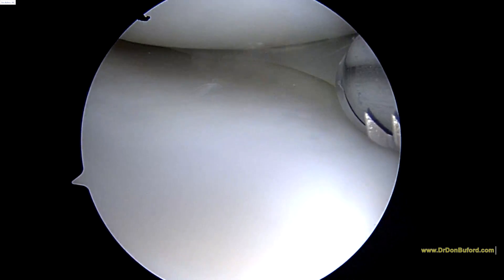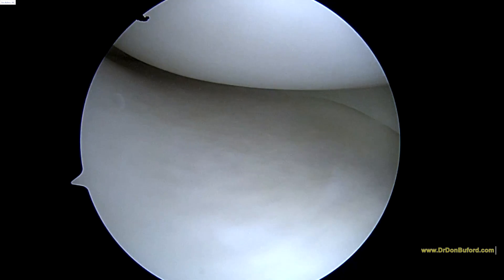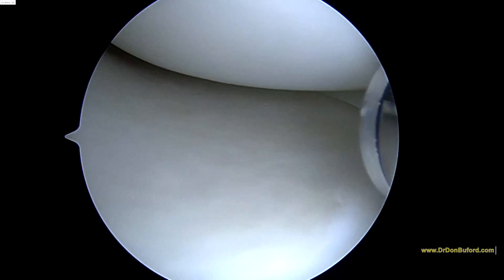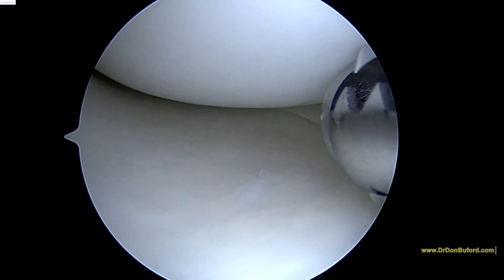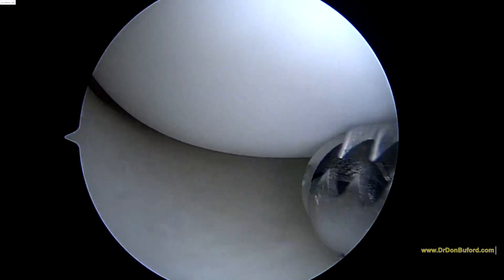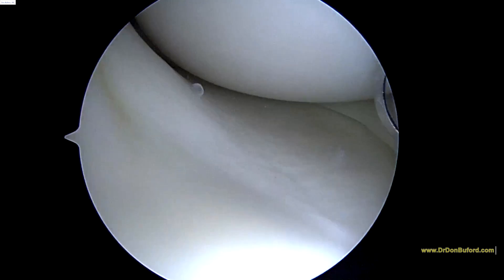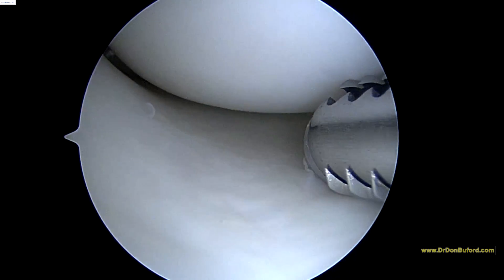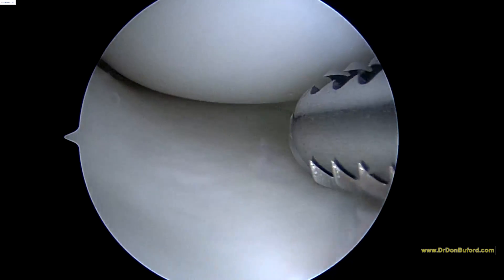The meniscus looks fine as we flex the knee down. We're going to look at the posterior horn and the posterior aspect of the femoral condyle, which is the top of the screen. See how nice and white and smooth these surfaces look? That's really good, that's normal. The bottom of the screen, below that metal shaver, is the tibial plateau. And that looks great also, so I'm happy with that.